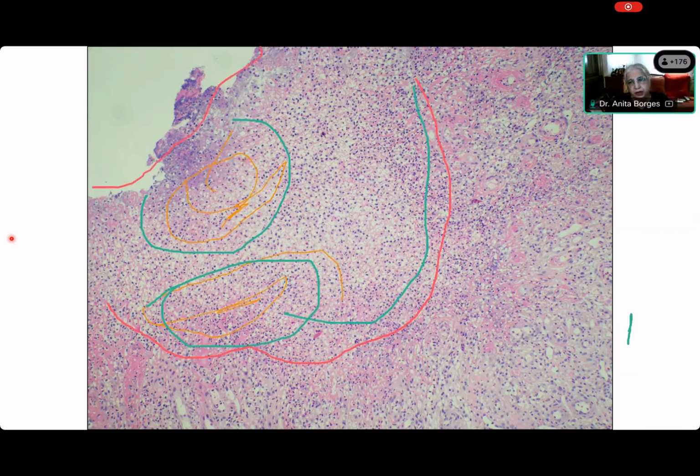All right, Priyamada, where is the base of the ulcer? Ma'am, this is the base of the ulcer. What color are you using? You don't have annotation. You haven't asked me for annotation. Ma'am, send request. Okay. Now come on, where is the base of the ulcer? Ma'am, the base of the ulcer is here. Here, where? Show me, what color are you using?